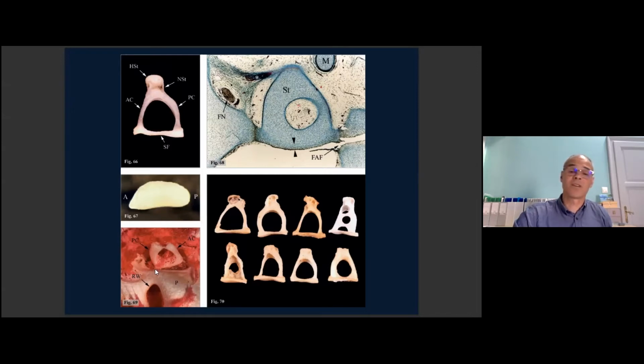If you have a cholesteatoma, a huge mass here, sometimes it is a very usable landmark, and the different parts of the stapes. For instance, this hole is because in this case there was an existing remnant of the stapedial artery.